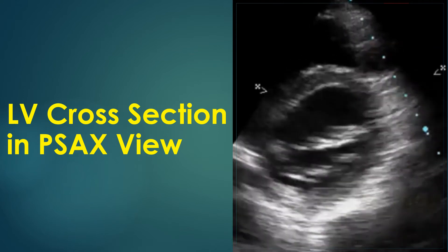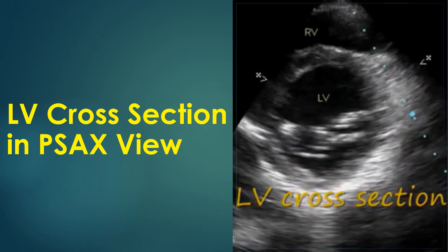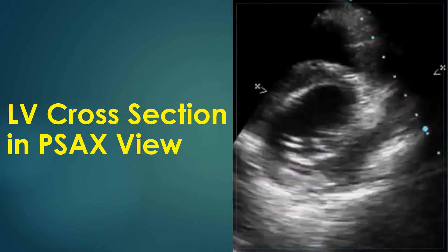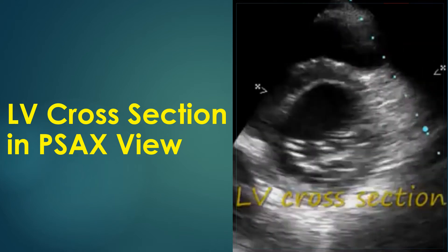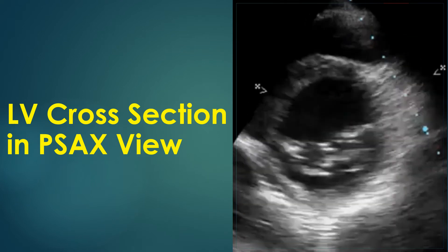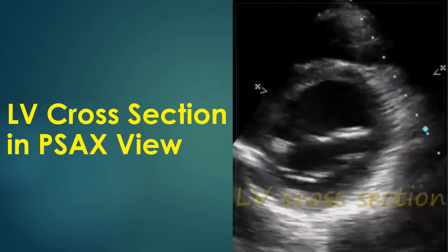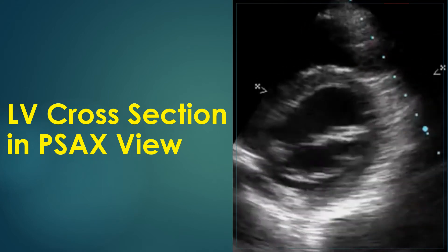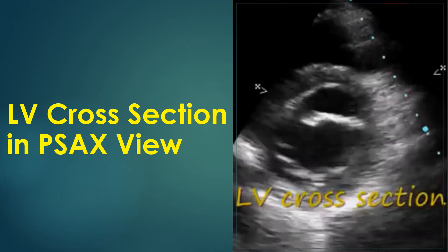Short axis imaging at the ventricular level can be obtained by directing the beam downwards from the previous position. It is used to assess the cross section of the mitral valve in mitral stenosis to quantify the mitral valve area. Left ventricular wall motion abnormalities can be visualized well in this view. A portion of the right ventricle is also visible beyond the interventricular septum. The left ventricle has a circular shape in this view and the right ventricle is semilunar with the septum convex to the right ventricle.